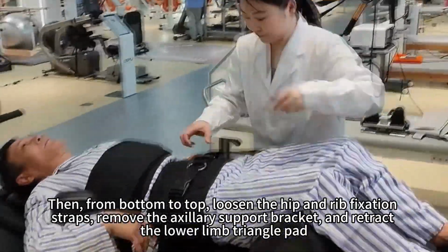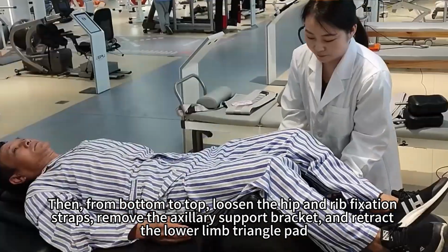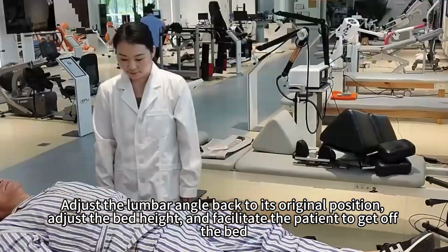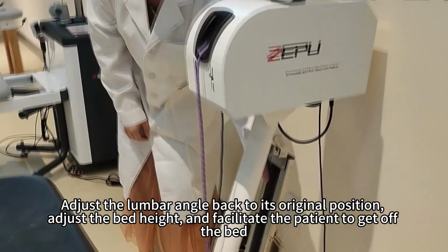Then, from bottom to top, loosen the hip and rib fixation straps, remove the axillary support bracket, and retract the lower limb triangle pad. Adjust the lumbar angle back to its original position. Adjust the bed height, and facilitate the patient to get off the bed.